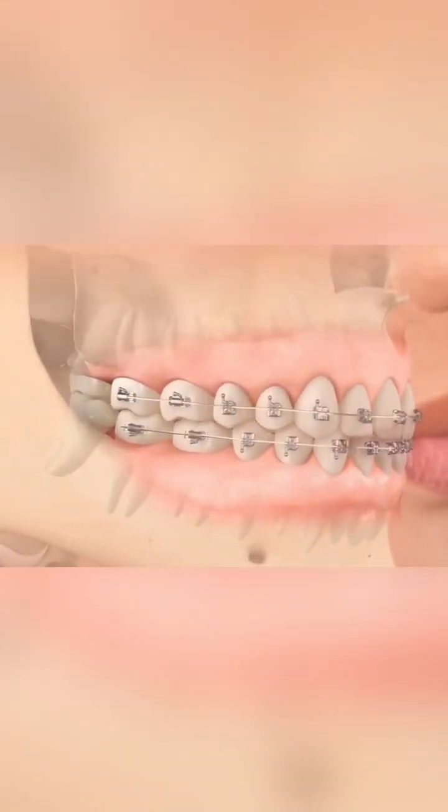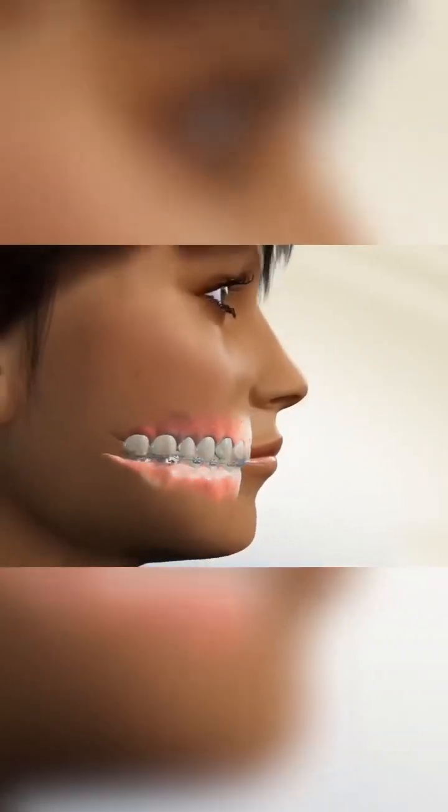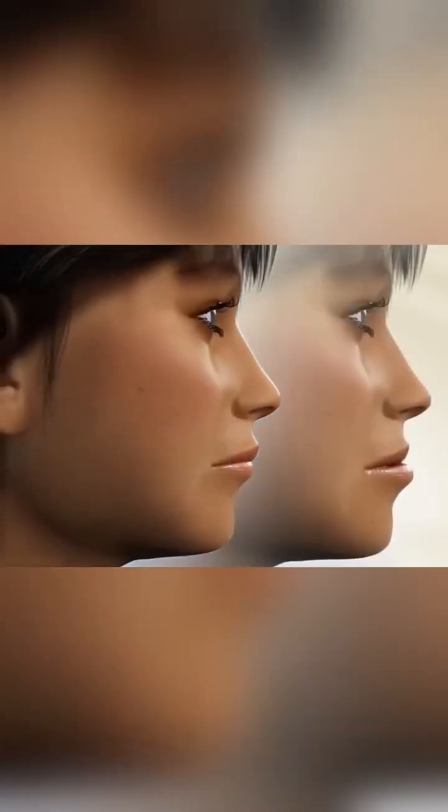After two to three years, any protrusion of the mouth will be noticeably reduced, the jawline will become smoother, and the overall facial contour will appear more refined.